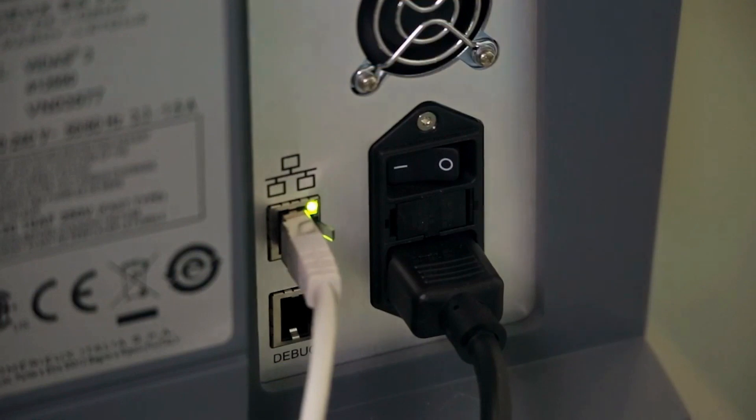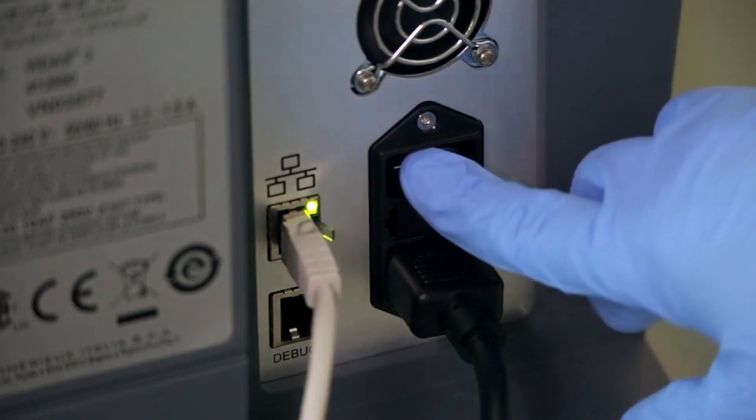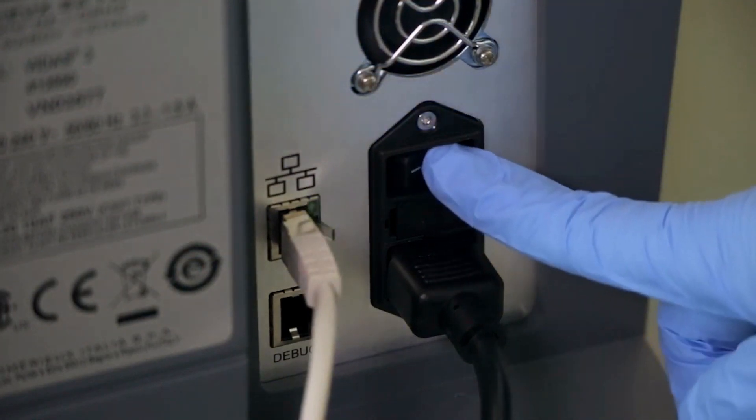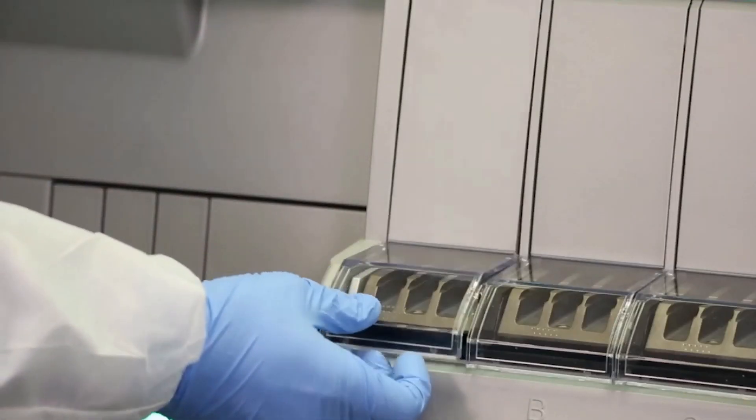Turn the instrument power switch to off and then disconnect the power cord. Open the section flap door.